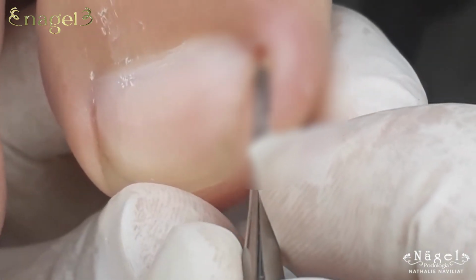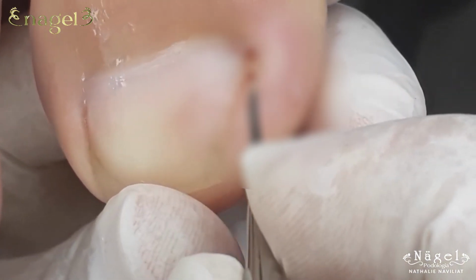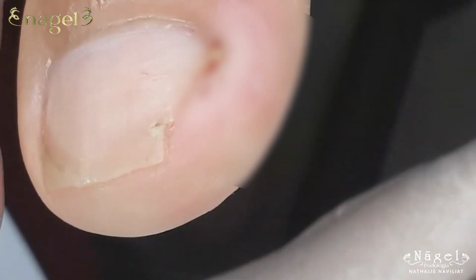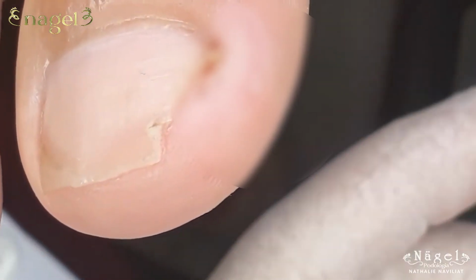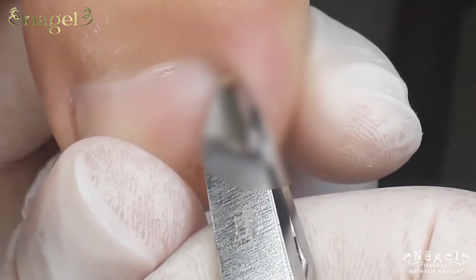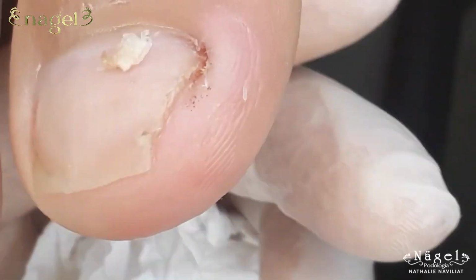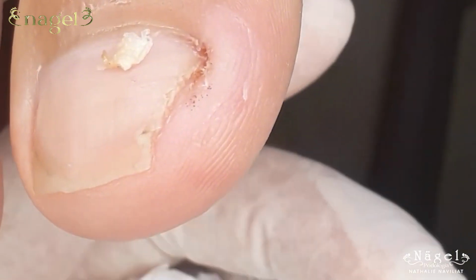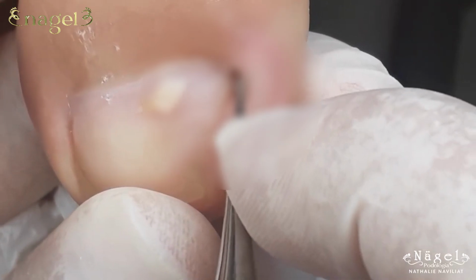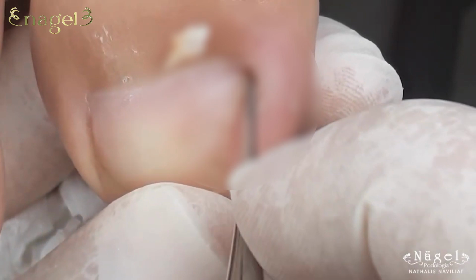With the area prepped, I grab my precision tweezers, a must-have tool for this kind of procedure, and carefully inspect the outer edge of the big toe. My patient says he's not feeling any pain and I check in. Everything okay? Feeling anything? He says he's all good, but I remind him, just because there's no pain doesn't mean it's all fixed. As a podiatrist, I know that even a tiny spur can cause big problems if not handled properly.